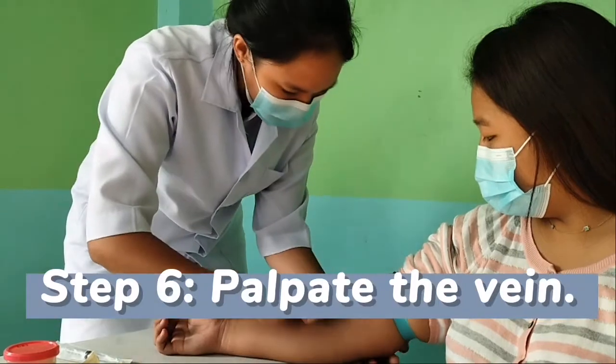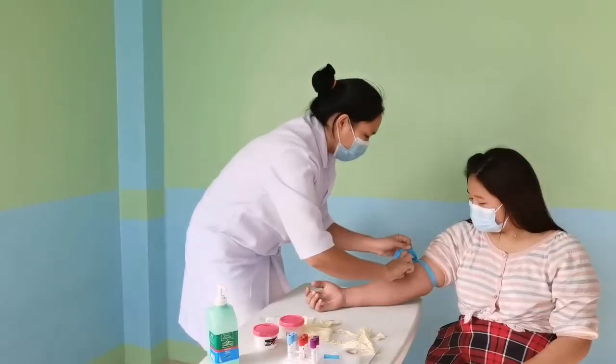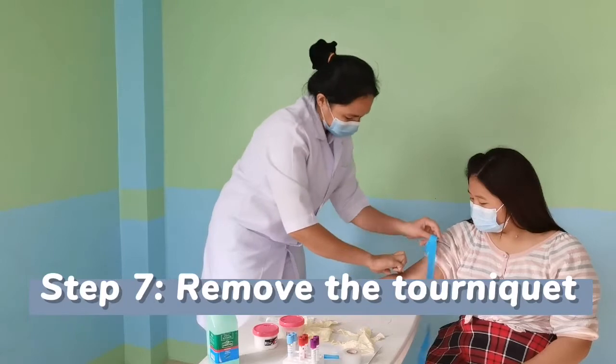Palpate the vein using your finger. After that, remove the tourniquet.